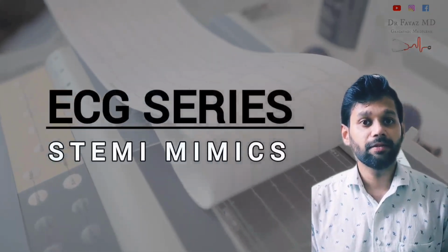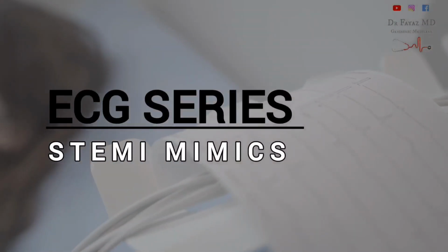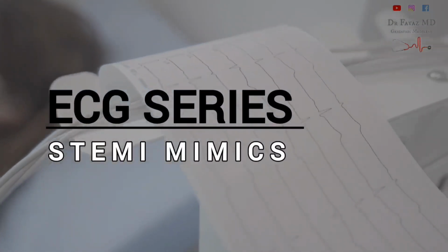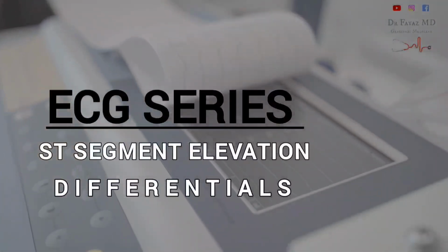Hi and welcome back. We frequently encounter ST segment elevation in ECG, but not every ST elevation is myocardial infarction. In this video, let us discuss the various differentials of ST elevation in an ECG.